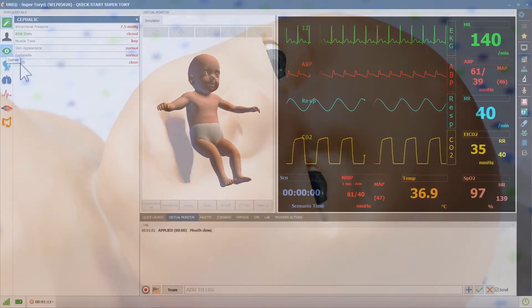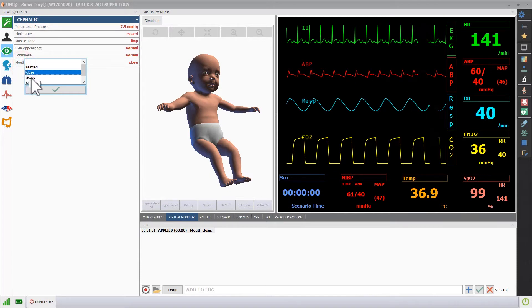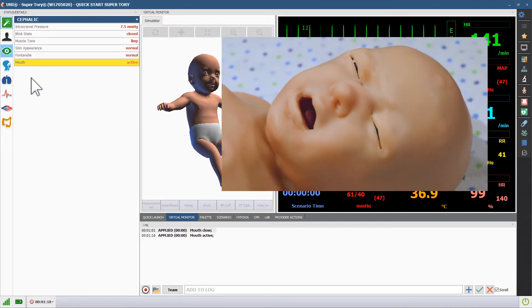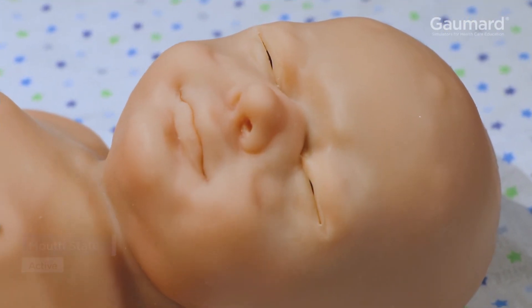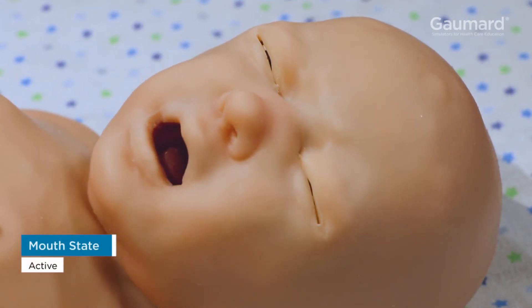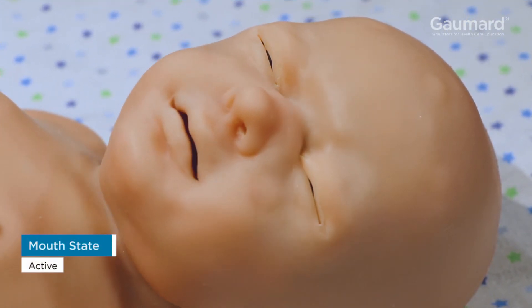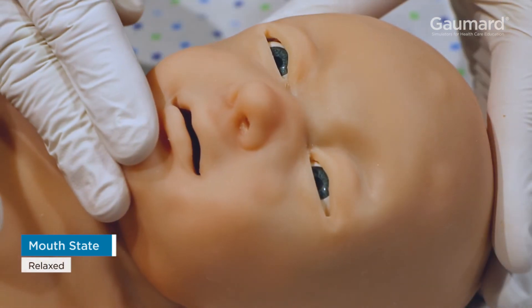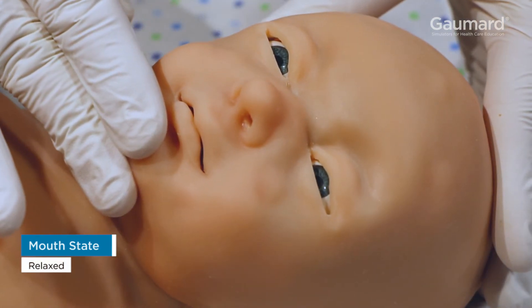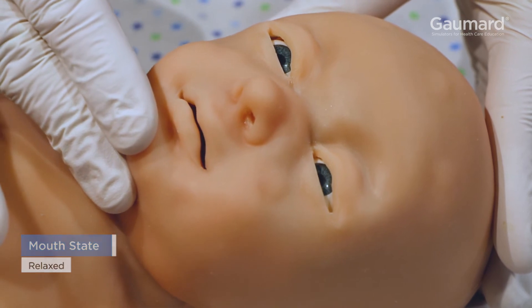To program the mouth movement, click the mouth vital and choose the desired state. Supertory's mouth can be active, clenched, or relaxed and able to be moved. Always set the mouth movement to relaxed before opening the mouth manually, as in the case with bagging, feeding, or intubation.